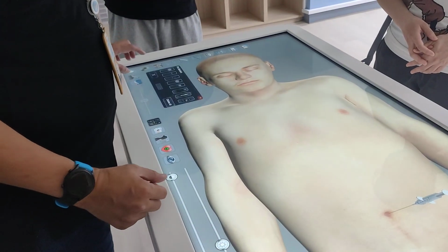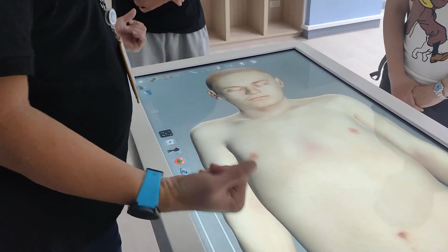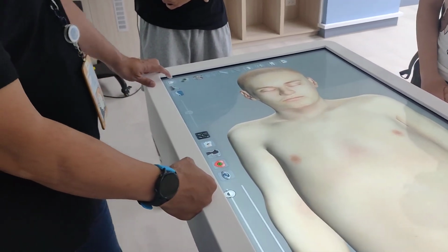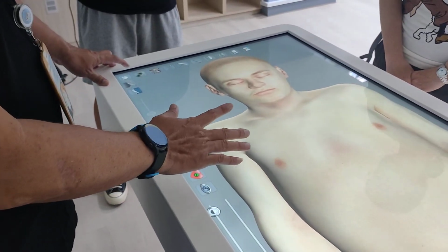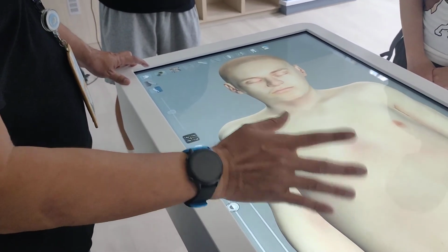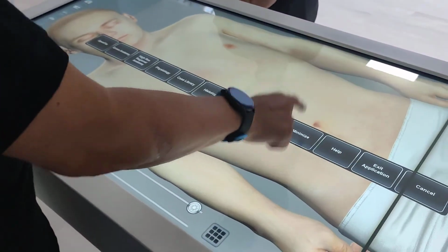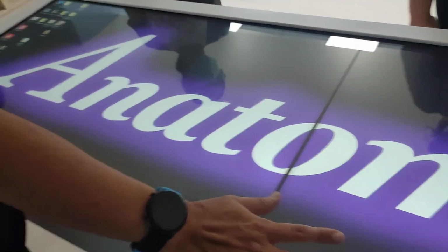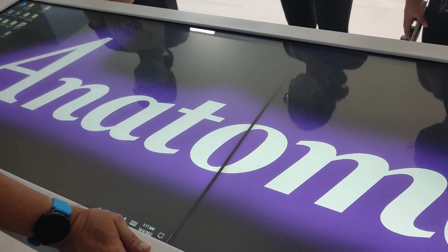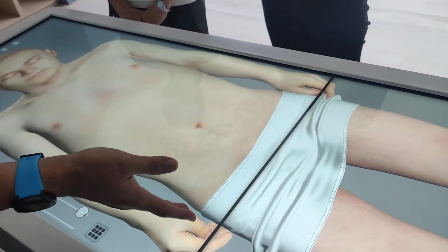Okay. So you want to take out and delete all, and nothing else. Okay. And this button. So if you want to go back to the Windows interface, you can push this and go to minimize, and you can come back. No problem. If you press this again and going back, right?